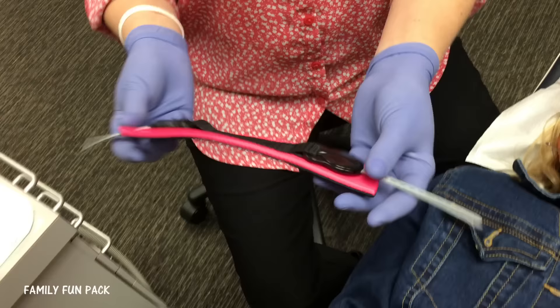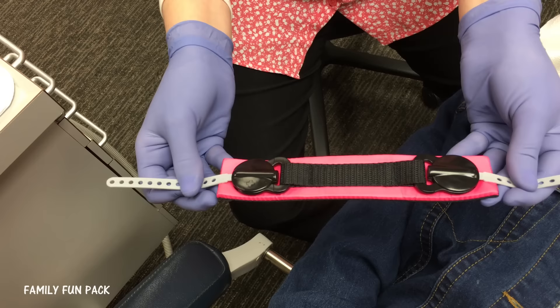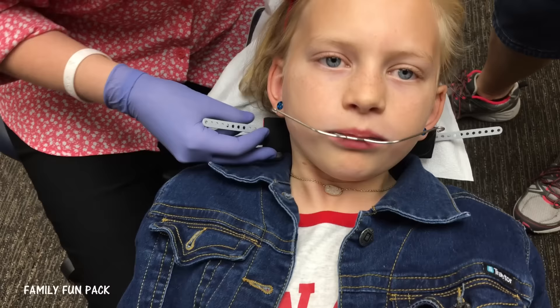When this is up against your neck and it's hooked in, the amount of pressure that we want — do you see those two dots on each side? That's the amount of pressure that we want. So if it's like this, it's too tight. If you're seeing kind of one on each side, it's a little too loose.